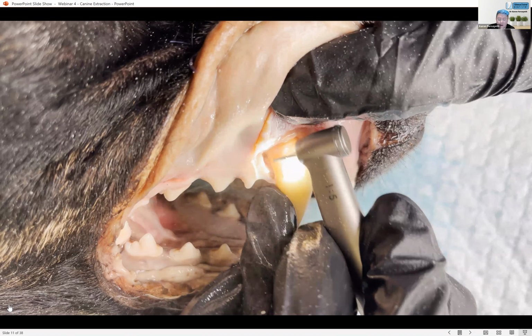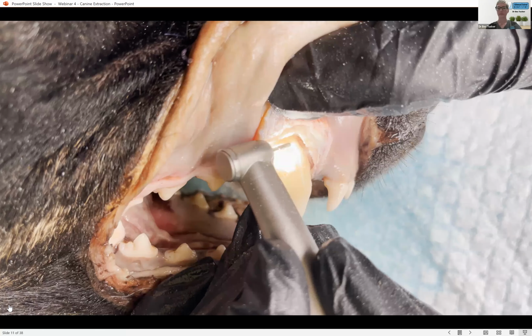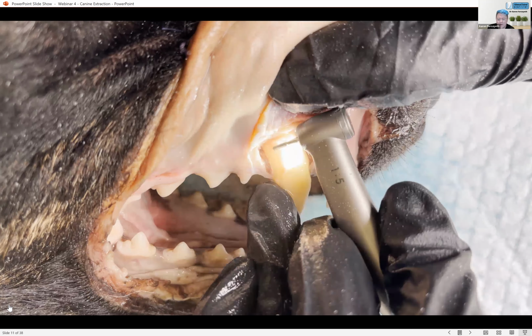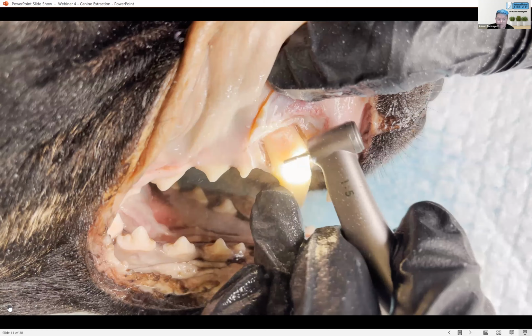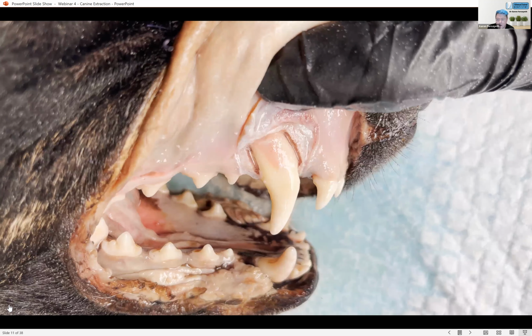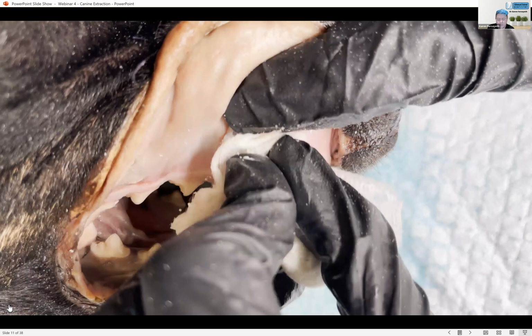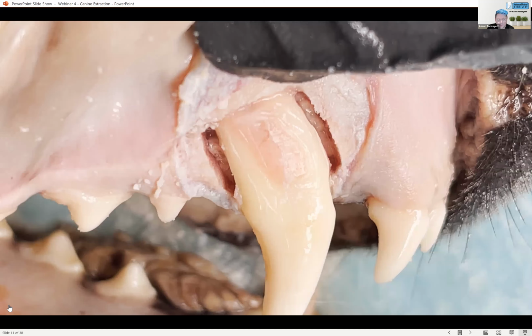But yeah, so probably 60% of the time is spent not cutting anything. You cut out, cut out, cut out, cut out. Yeah. So here Beck is going over the buccal surface and doing that colouring in and removing a lot of bone. So now we can see there's quite a lot of root exposed, and I've decided to zoom in when I was filming.